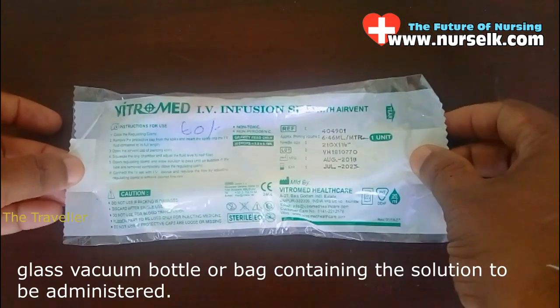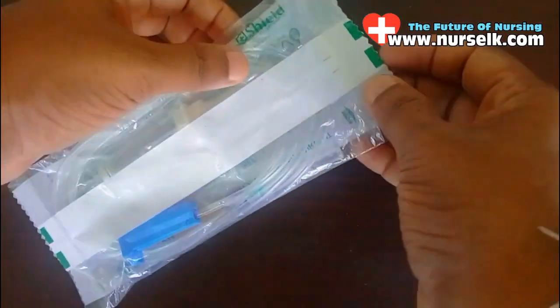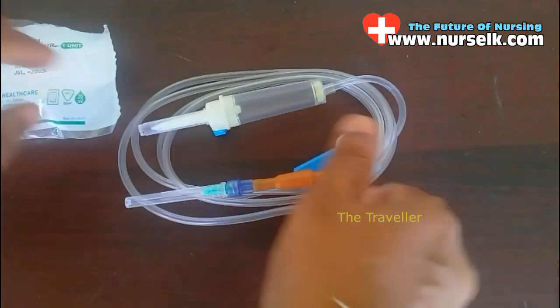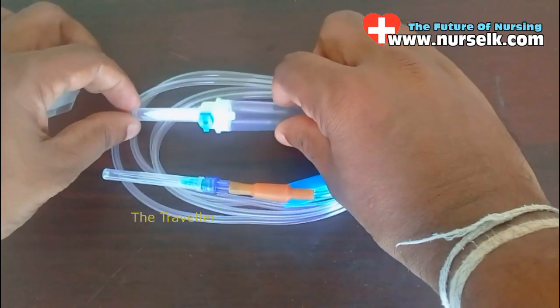The IV infusion set includes a plastic, glass, vacuum bottle or bag containing the solution to be administered. Here we have an IV infusion set — let's tear it open here to take the IV infusion set out. Right here is the IV infusion set; let's go through it.